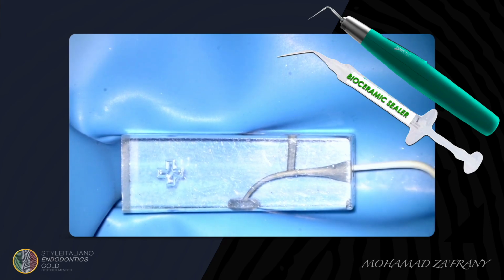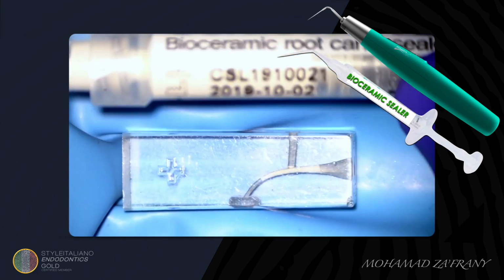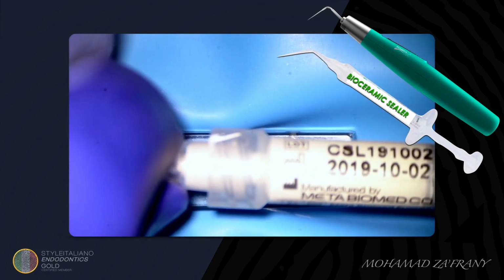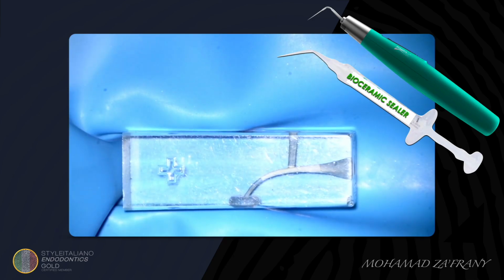We introduce the bioceramic sealer in the mid portion of the canal. Make sure that the tip is free in the canal, not locked. Sometimes we have a little amount of sealer on the nozzle of the needle.